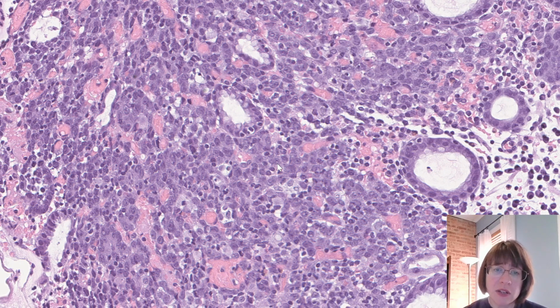And in this case, this turned out to be strongly keratin positive. If I am really not sure if this is carcinoma or not initially, I may do a panel with S100 and CD45 in addition. So I would expect those to be negative in this neoplasm, which does turn out to be a carcinoma. So then my next decision point is what type of carcinoma this is.